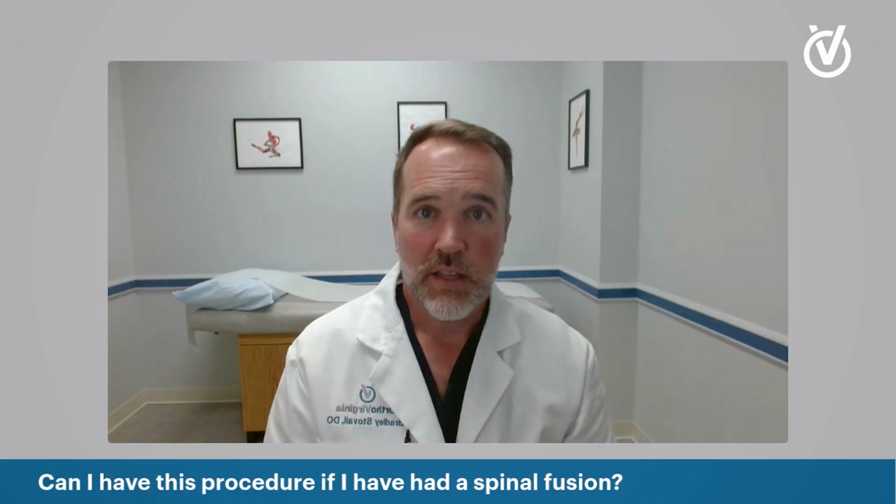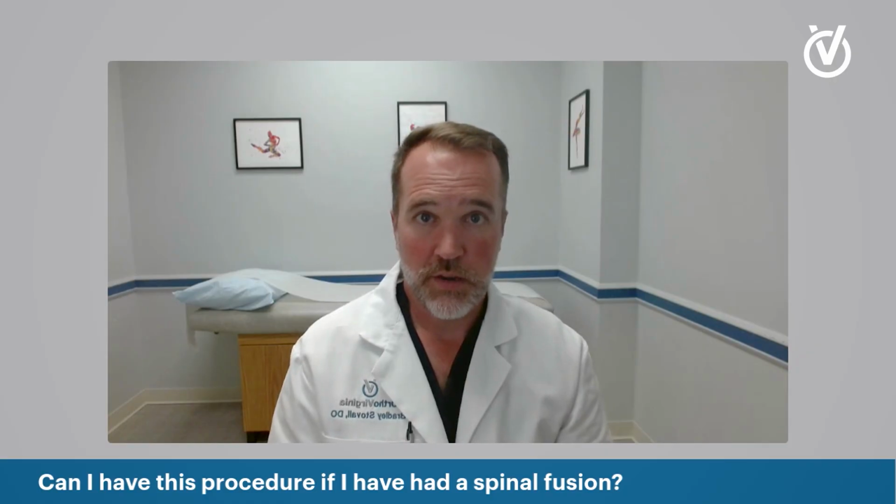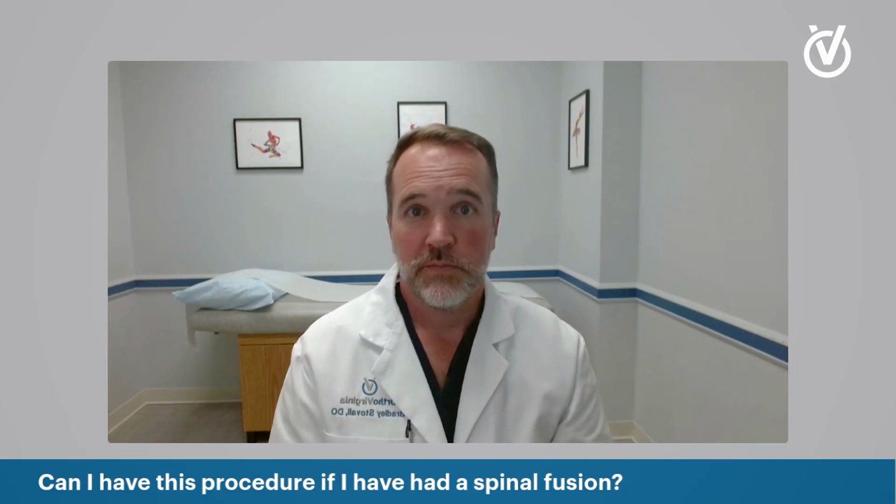And then that's the area that has that bone inflammation. So oftentimes it's not the level of the fusion that's the problem, it's the area above or below. So if we do see those inflammatory changes, we are able to treat them.